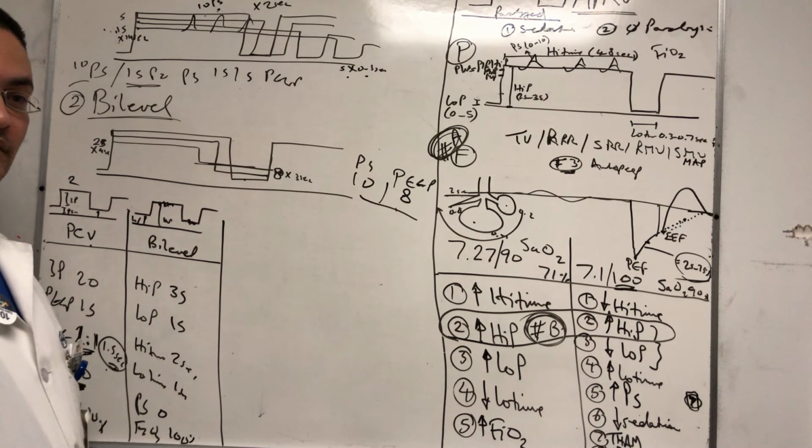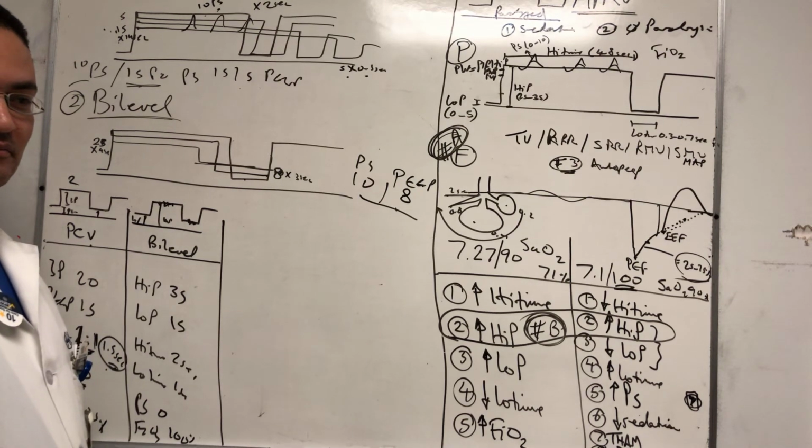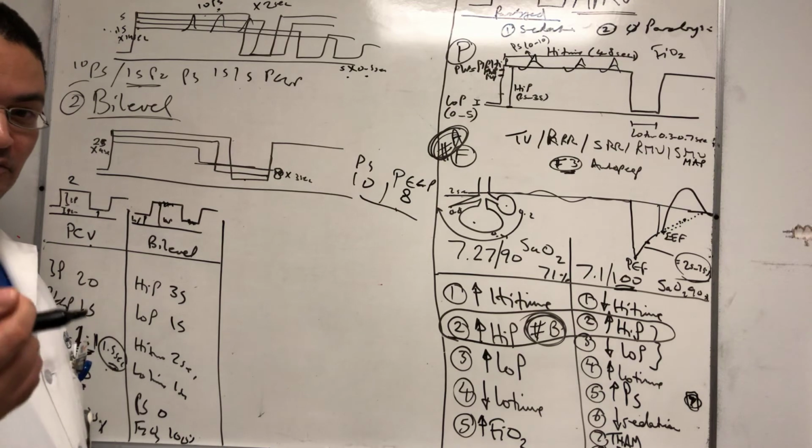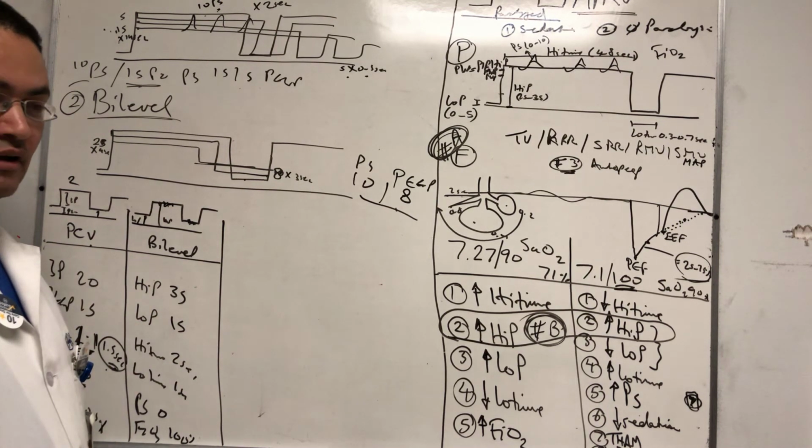What's going to happen to Professor Megan? My lungs are going to explode. No. Your lung is elastic. Your lungs are great. Nothing is going to happen to them. You're going to die. You're going to have a cardiac arrest. Why? Because what's your CVP? Less than 5. Okay. 35 of pressure in a normal lung will be translated 100% to the alveoli.